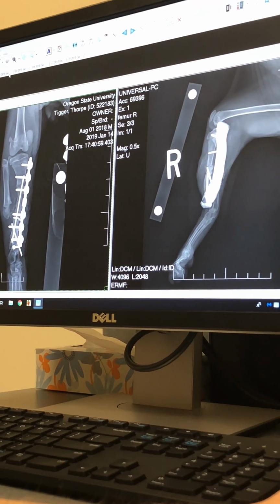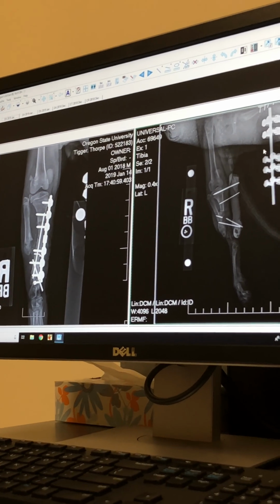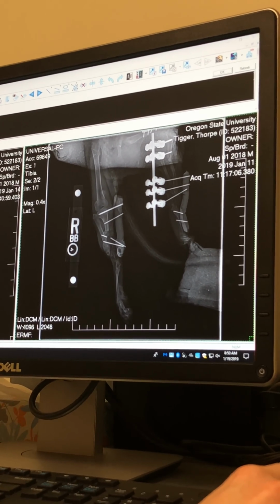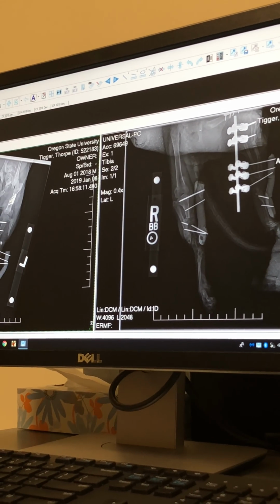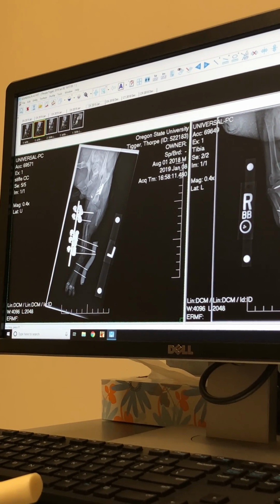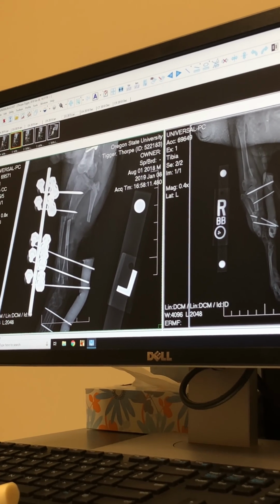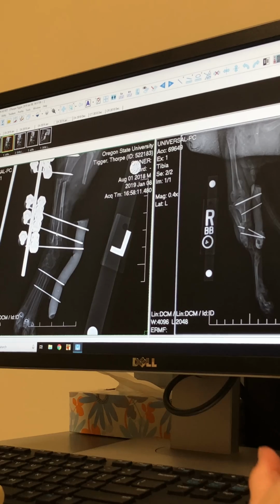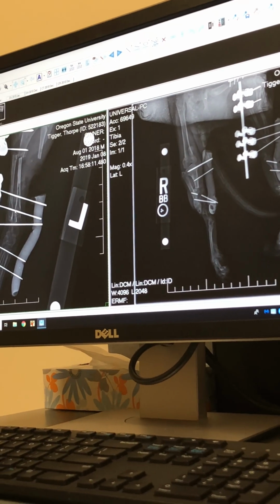And then in terms of his other leg, the left leg, let me find his x-rays there. So he has an external fixer that goes on both sides in part of it, and I'll get it better, I think. I'm trying to make sure his x-rays. Here we go. This is all the left side. So then, the left leg. Same deal. We took the other bone, moved it over to make a full weight-bearing axis again. And we have the pins that are going through with a big rod. And then in the ankle, that one we actually were able to arthrodesis or fuse, because it was also all over the place, not a real joint. If he bore weight on it, it would just collapse down. Do you know what I mean?